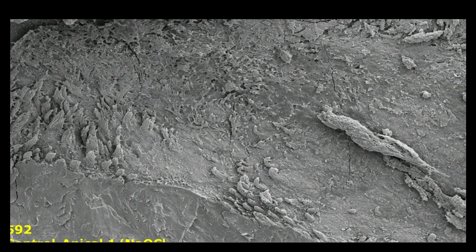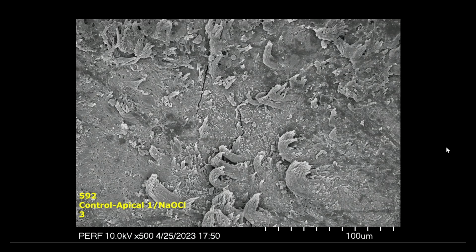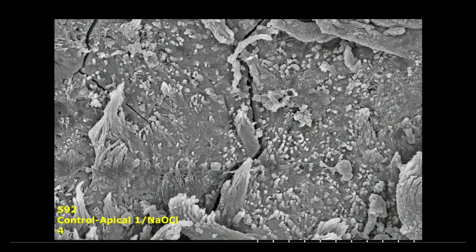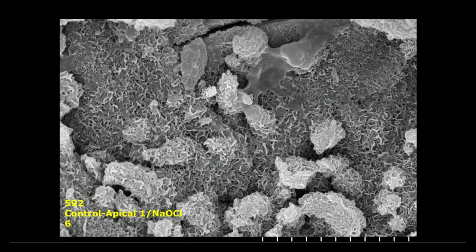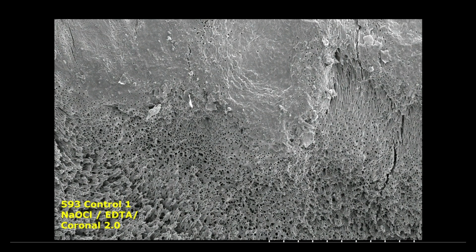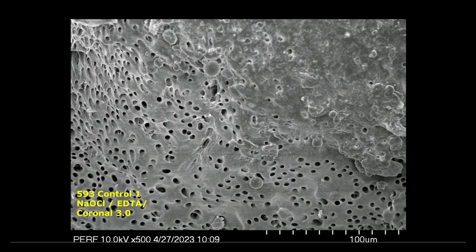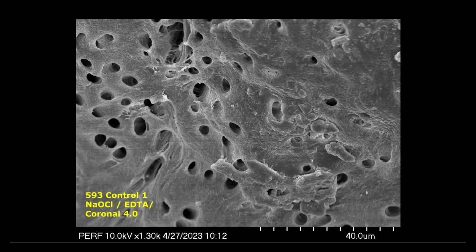Obviously, to be really expert at this, you have to look at thousands and thousands of images, but Rome isn't built in a day, and you have to start somewhere. So this is where we're going to start. We're going to take Rick's idea. We're going to look at these control cases, and I'm hopeful by the end of this experience in looking at these control teeth that you'll have a lot more confidence in your judgment, and you'll be able to calibrate your judgment a little better.